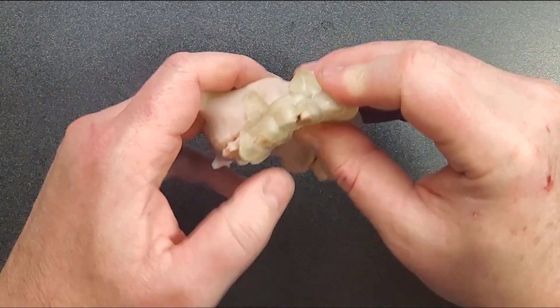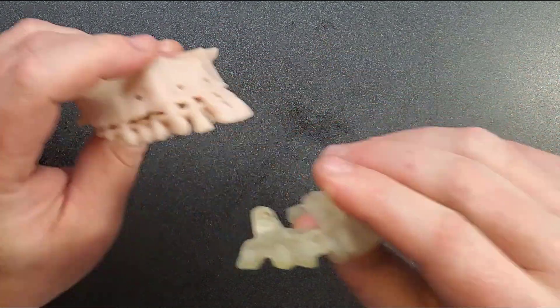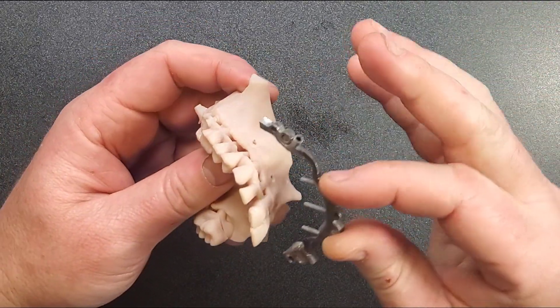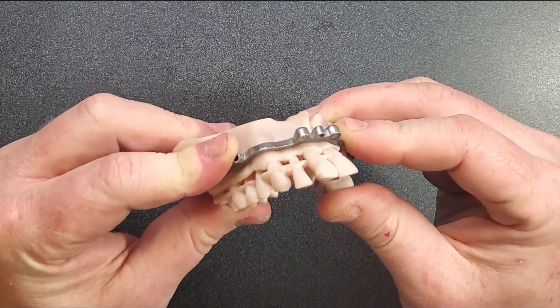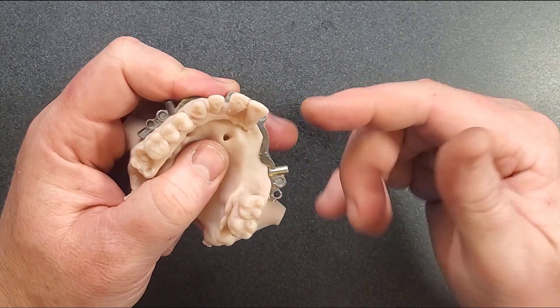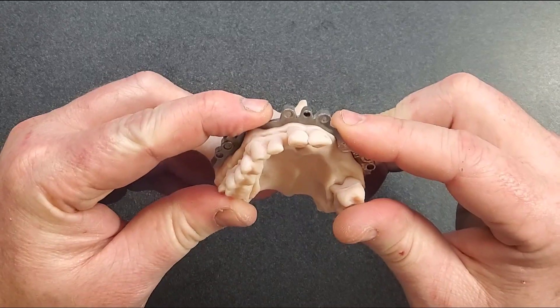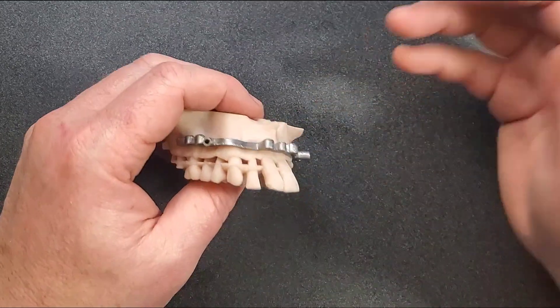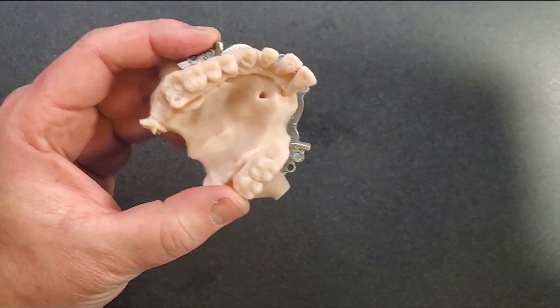I'll show you just the maxillary portion as well, just so you can see it all. Once again, you put on your tooth-supported guide and just drill pin holes. As soon as you're done with that, take it off, toss it. With that done, you would bring your reduction guide into the mouth, just line up the pins — this will press all the way in. It's fully anatomic, it goes all the way to the bone, which is nice because, one, it's closer to your level of reduction and keeps you in that plane better. Secondly, I just like the fit of that much better, where I can visually see that it's all the way flush against the bone. That is a little bit more work on the planning phase on my end, but from a customer perspective, if I'm doing this surgery, I feel much better about that being anatomic going all the way to the level of bone.